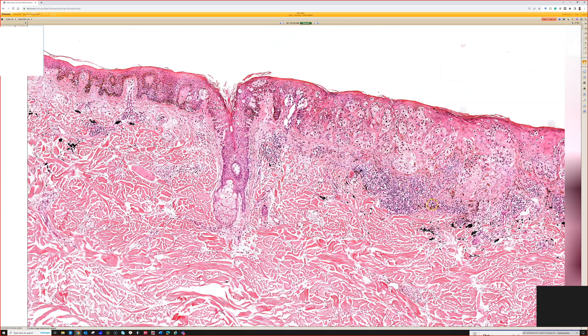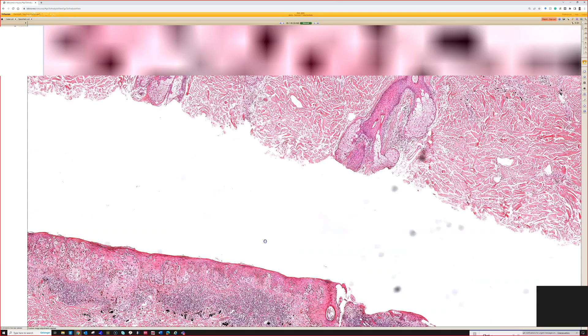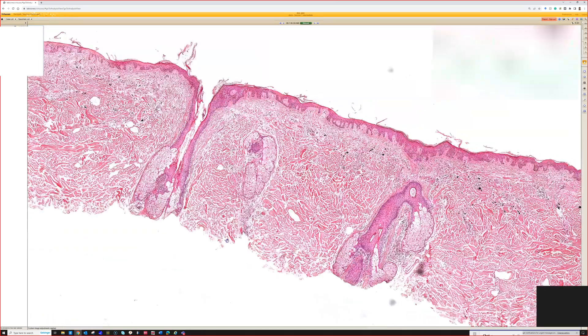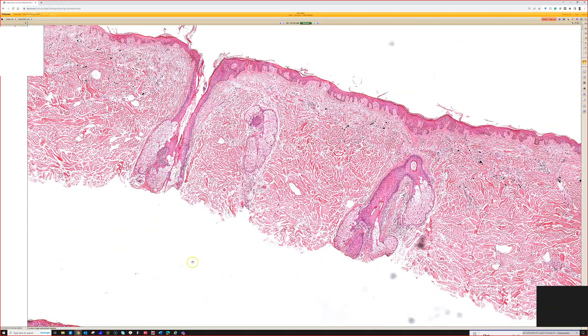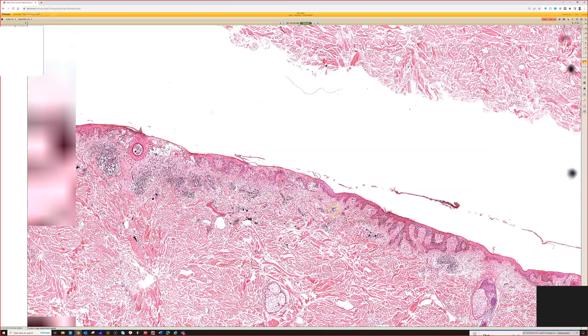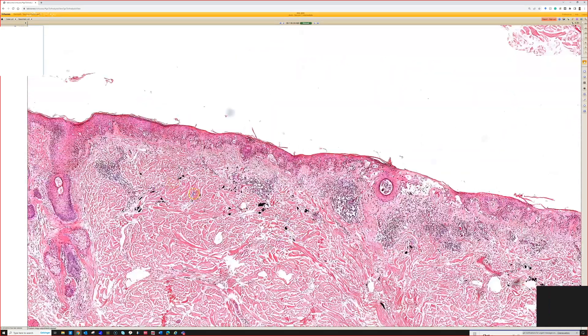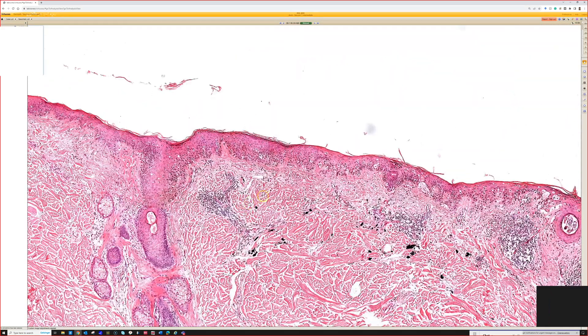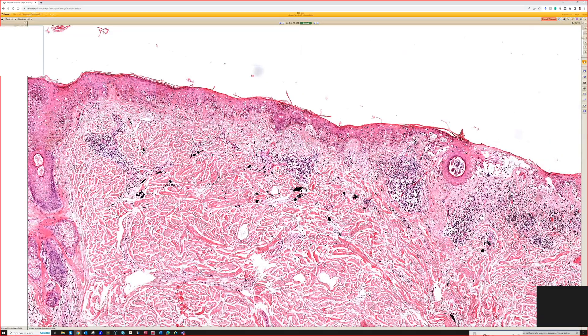I'd call this one superficial spreading type. Some people don't even use those old-school classifications or subtypes for melanomas anymore — it's kind of for historical purposes and for pattern recognition for pathologists. But again, clinically it doesn't really matter.